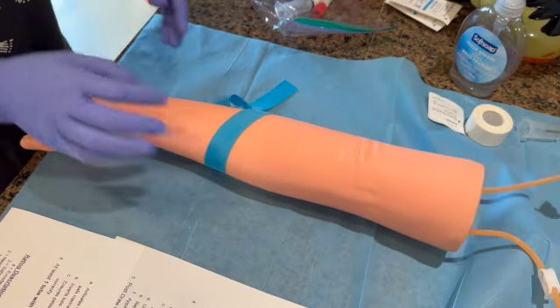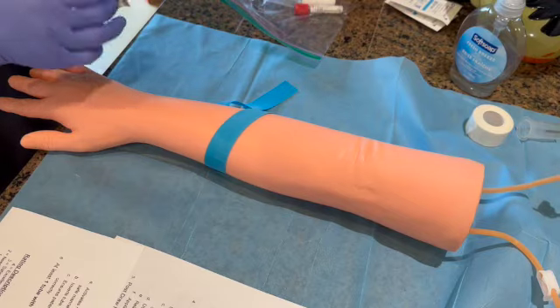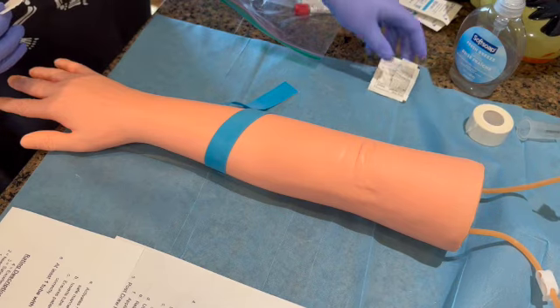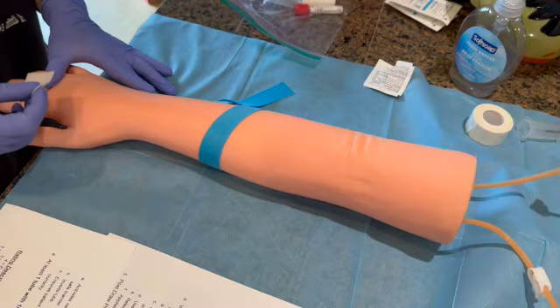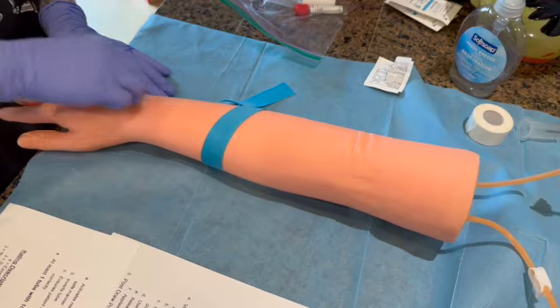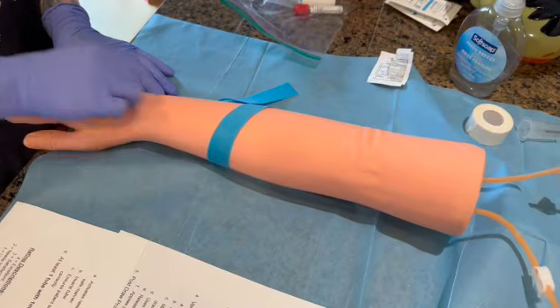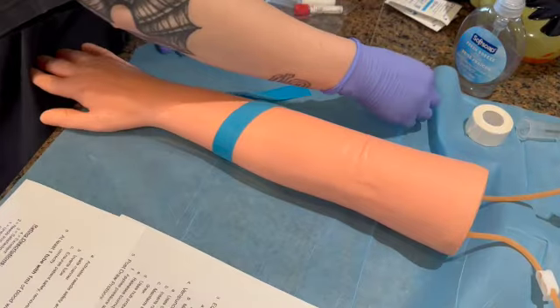Since that took me a minute to decide, I'm gonna take that tourniquet off. I'm also gonna work on getting Robert aseptic, so we're going to grab our alcohol wipe and prepare Robert's hand with nice continued friction. And there's that.